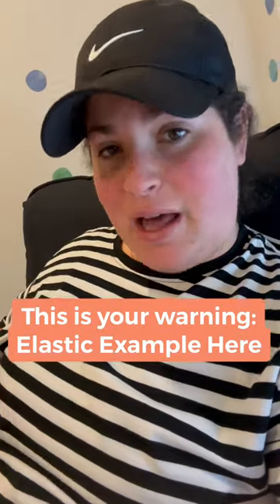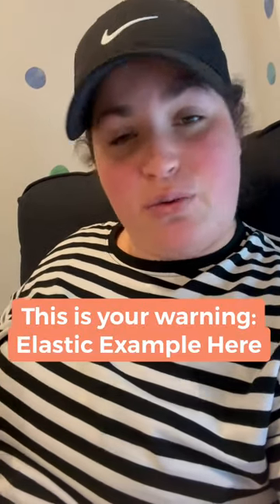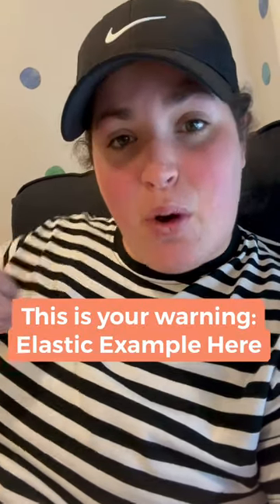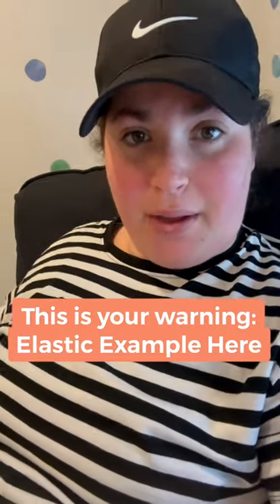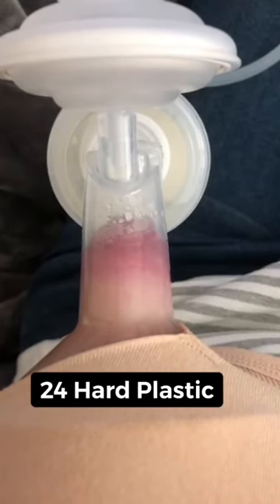I'm about to show you a video of elastic nipples — this is your warning if you don't want to see it. It's going to show the nipple pulling in so you can have an idea about what it looks like when you are pumping. This mom started off by sending me videos with 24mm flanges in hard plastic.